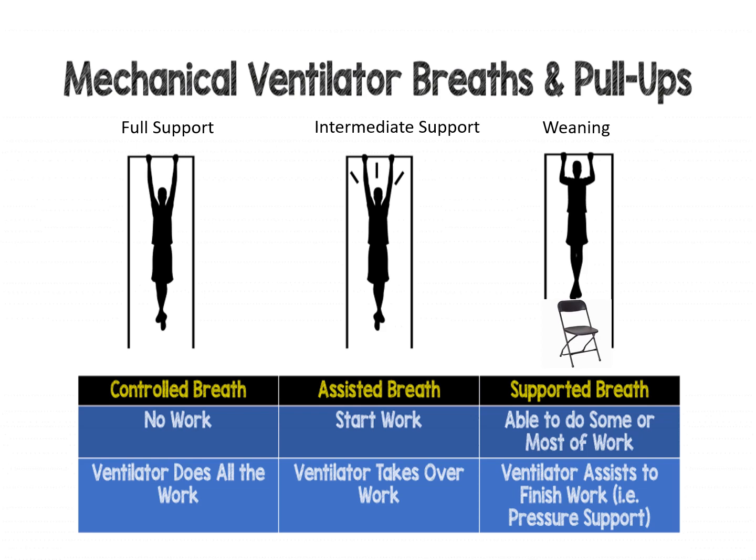Then there is weaning, where the patient is doing most of the work. They're doing all the triggering of the breathing. The only difference is, instead of trying to pull in the air all on their own, they will get some positive pressure to decrease that workload so they don't get tired too early.